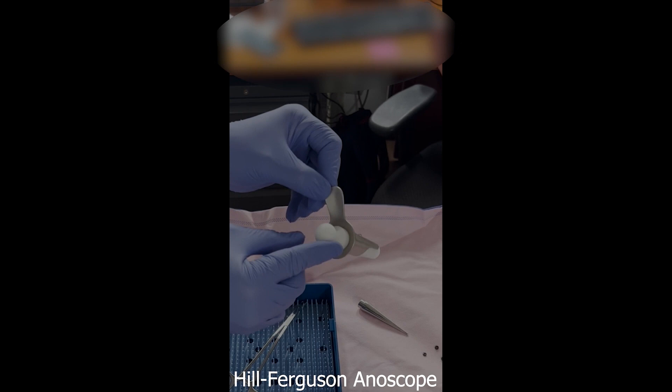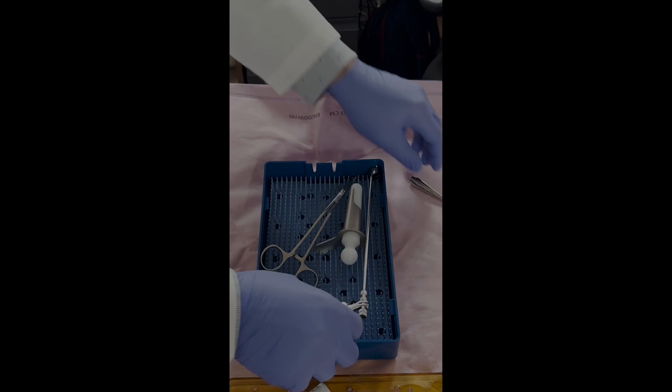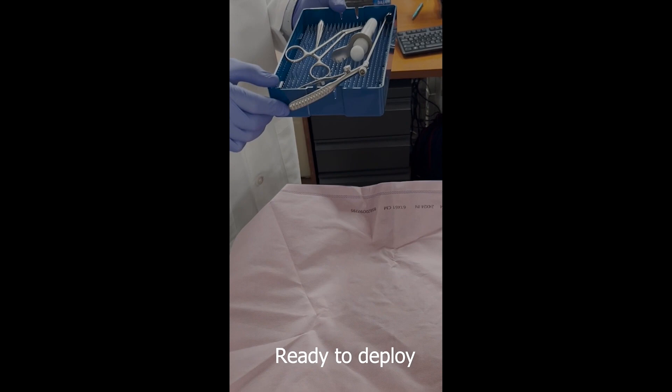The other instruments you will need are grasping forceps and an anoscope. Suction ligators, which pull the internal hemorrhoid into the banding instrument, are also commonly used. However, in this video we will be focusing on the technique using the McGivney ligator and atraumatic forceps.